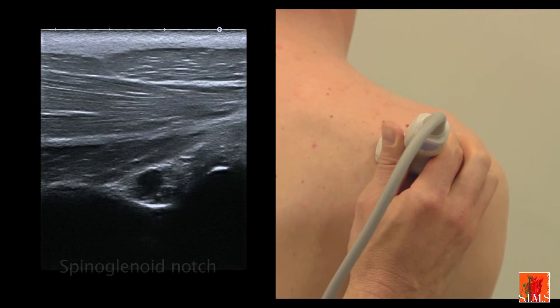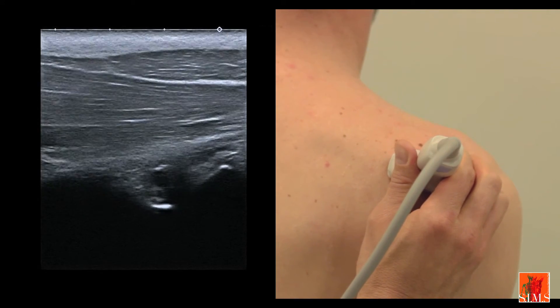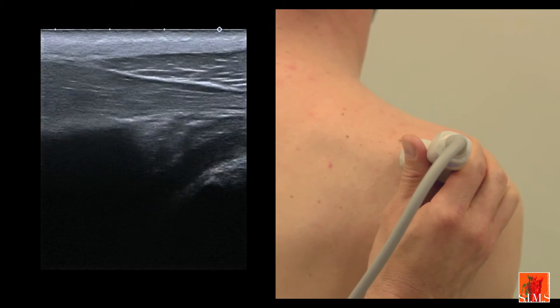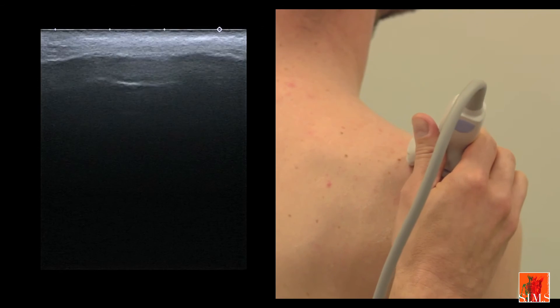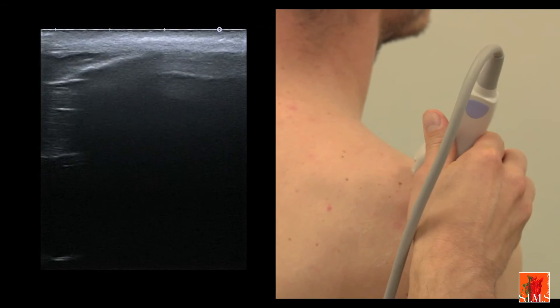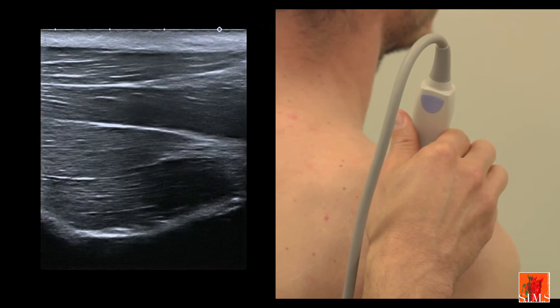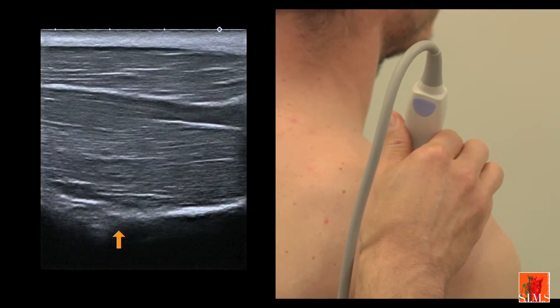If we travel upwards, still in an axial plane, following that pedicle along the deep surface of the infraspinatus muscle, we will see it go under the spine of the scapula. This is a blind zone. Then we will pick it up again in the supraspinous fossa, still in contact with the scapular bone, and follow it upwards as far as the suprascapular notch.